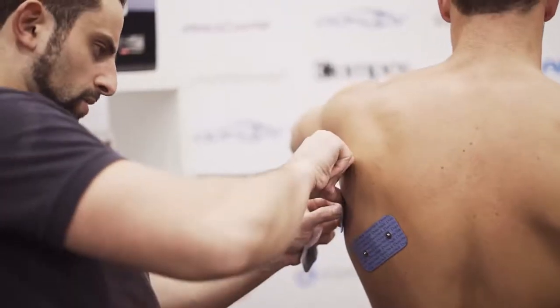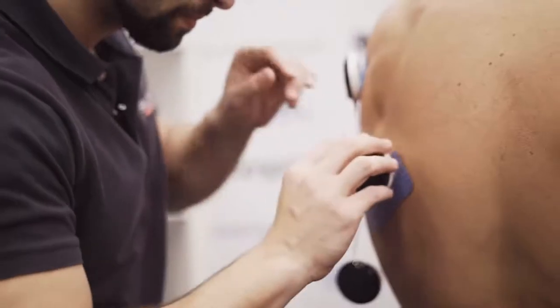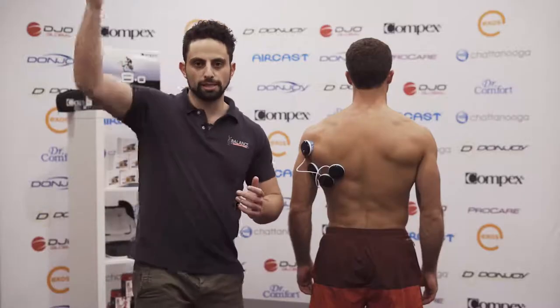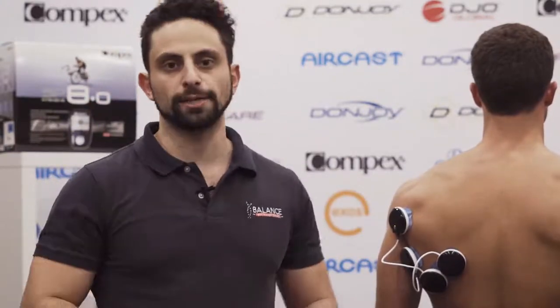A really common dysfunction is the inability to use the latissimus dorsi muscle properly when you're raising the arm above head. The lat has to lengthen and contract at the same time so it can control the shoulder blade.